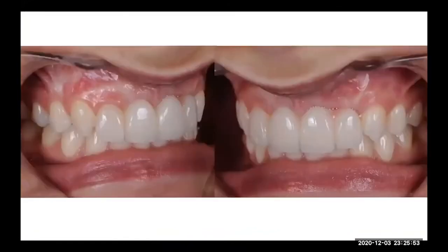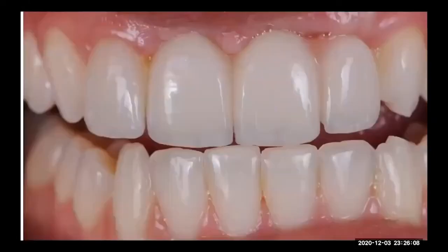You see, the soft tissue still needs some work, needs some regeneration, but I think the result is acceptable. From where we started to now, I think it's really acceptable. But you see the vitality of the incisal edges is not ceramic, it's not buccal buildup. It's something that we create from the palatal of the tooth. So we can create shape, we can control the value.